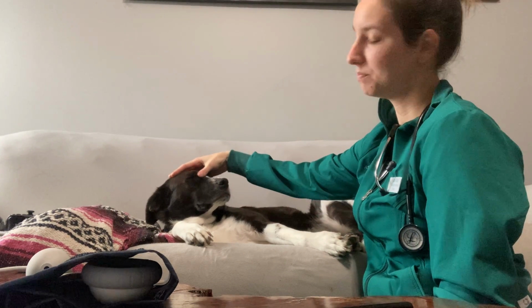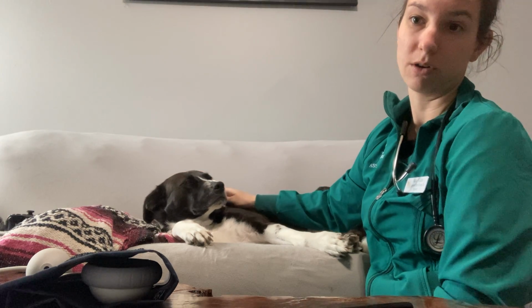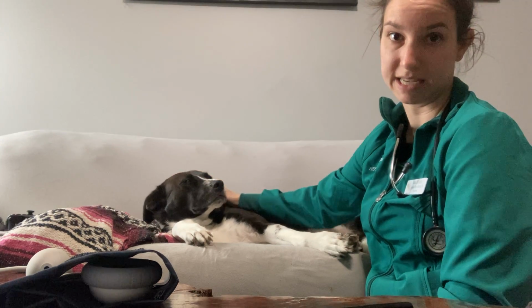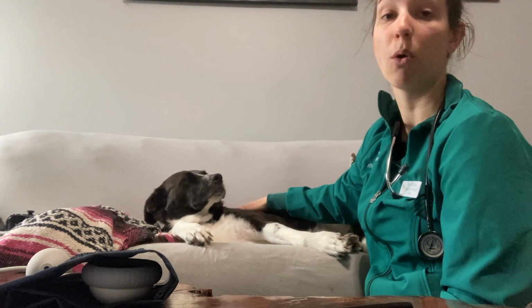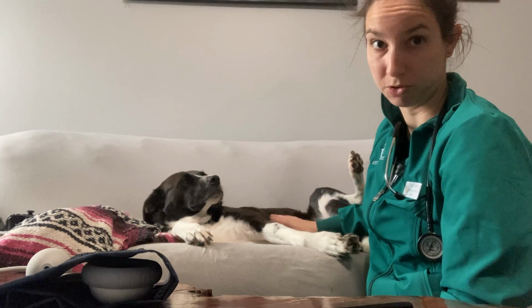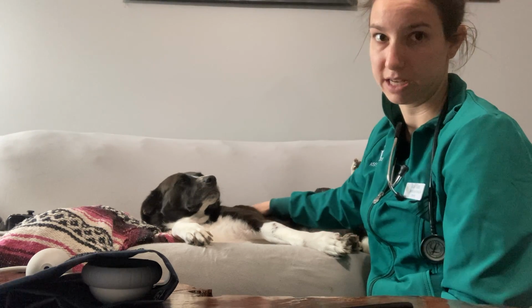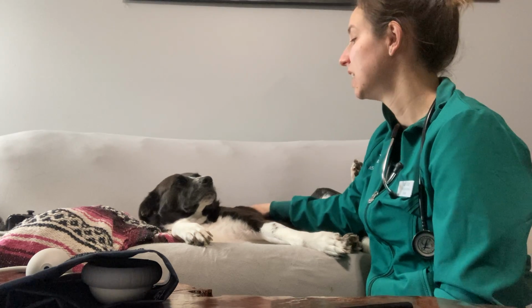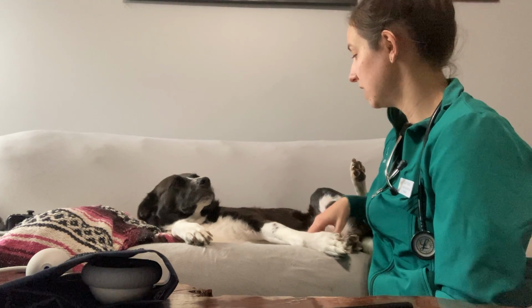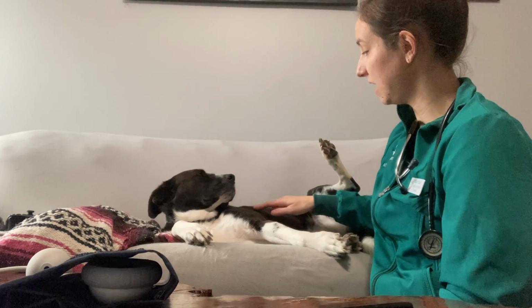Once we have our pulse, and in this case we were able to knock out our oxygen saturation in the same go, now we can look for our respiratory rate. Now Sadie is in a very poor position for checking respiratory rate, mostly because I cannot see both sides of her chest to check for equal and bilateral chest rise.